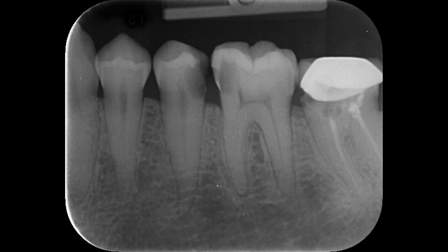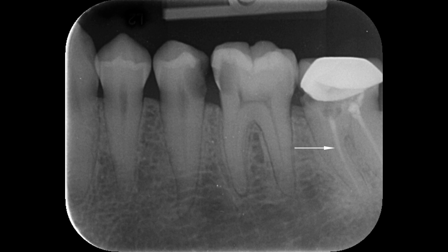This is the preoperative radiograph of the patient, where you can see the carious lesion at the mandibular second premolar tooth and the mandibular first molar tooth. The caries is at the contact area — the interproximal area — and both teeth are involved, which causes discomfort to the patient. You can also see that the patient had previously done root canal treatment of the second molar tooth, though the canals are not very well prepared.